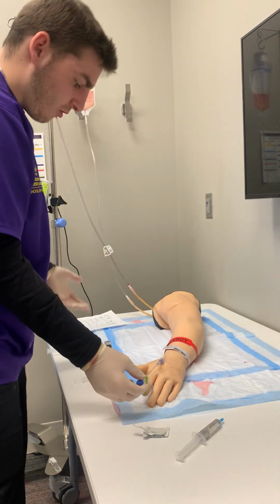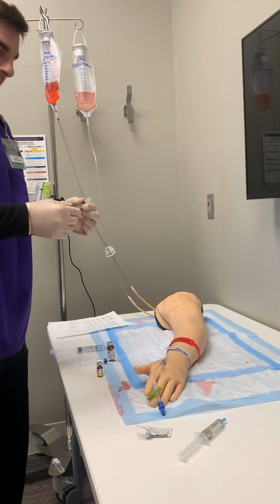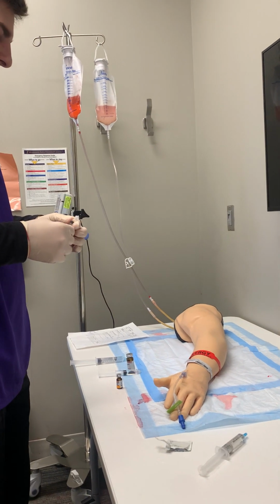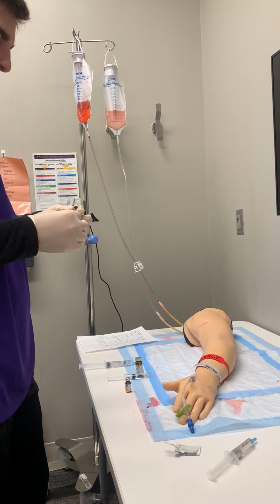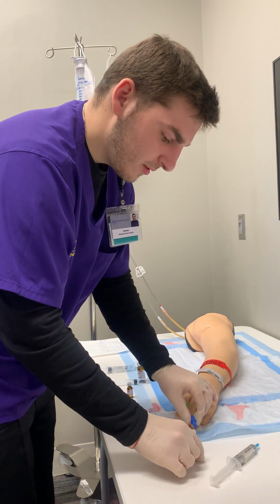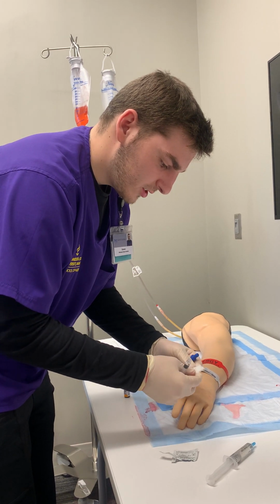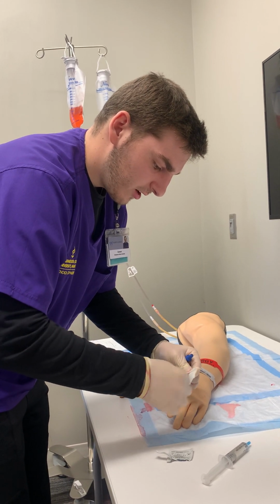So now that I know that my vein is patent here, first I'm going to give you ketorolac because I know you're having that severe pain, and this will help until I can contact the provider and get you a stronger medication. So I'm just going to scrub the hub again for 15 to 30 seconds, just to make sure that both things are sterile.